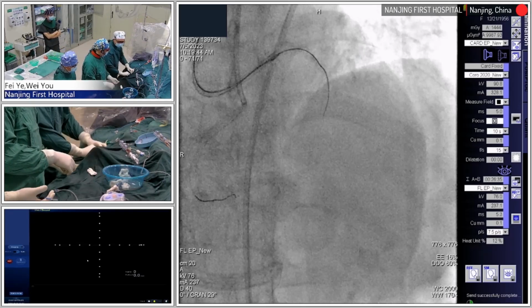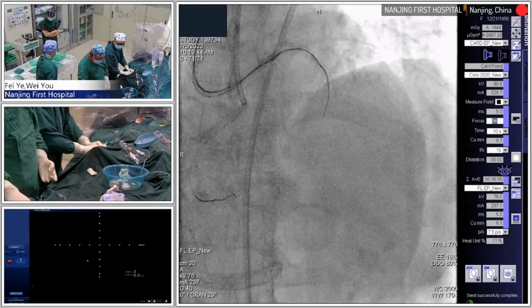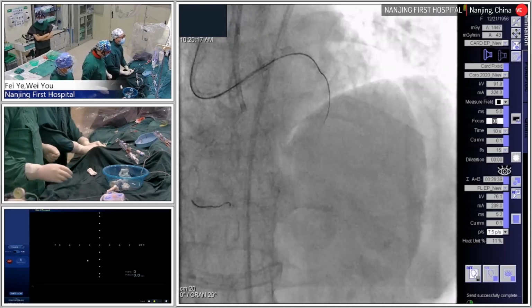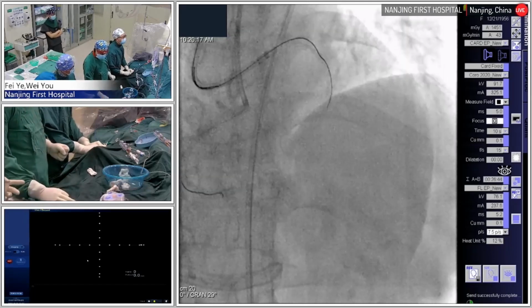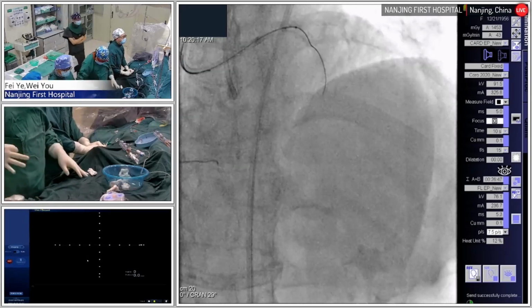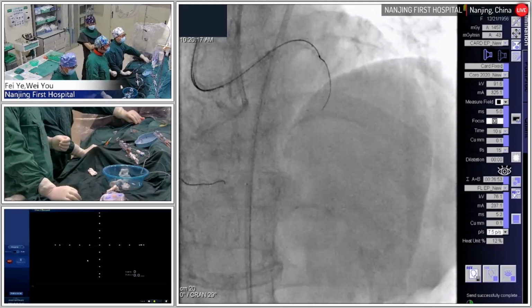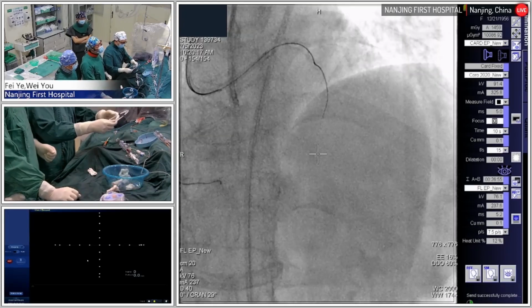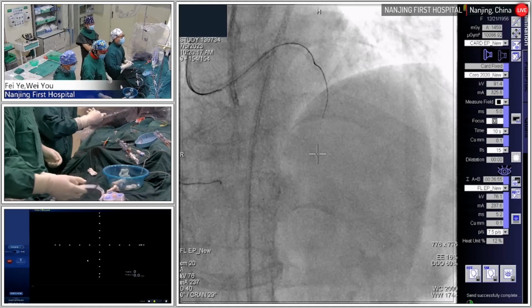So Chief, do you have experience with a low profile double lumen catheter like the Sasuke? As we all know, in our Chinese market we have this device now. I think a lot of domestic companies in China have a very good micro-catheter double lumen catheter compared with Japan. I don't have any experience. I also heard some experts working in China think that the local company double lumen catheter is very good.